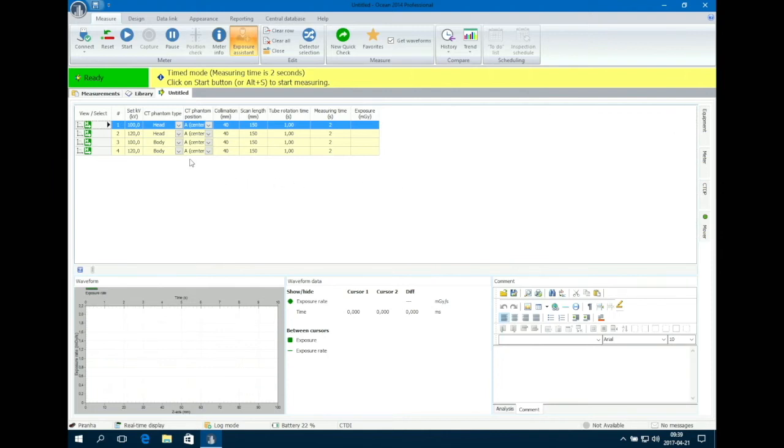Now select your CT phantom type in the drop down menu. In this case a body phantom. Enter the following information from CT console into Ocean. Set KV.